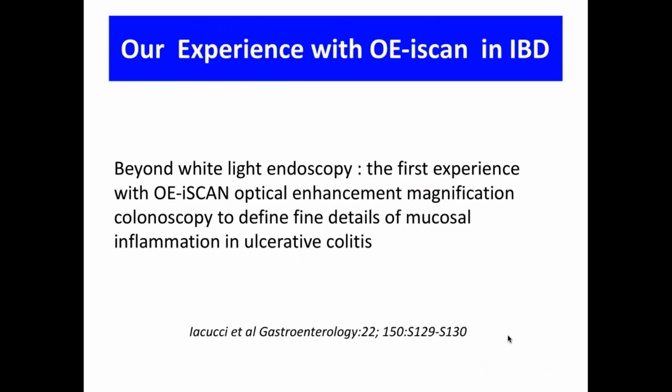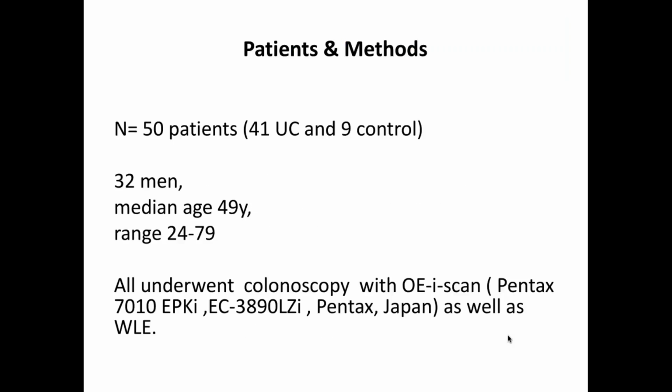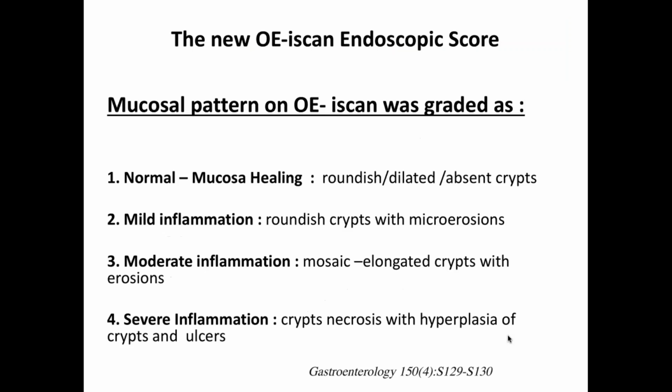So at DDW this year, we have presented our first experience beyond the white light endoscopy using the new optical enhancement. And we have showed that the optical enhancement can see abnormalities in detail. And we have defined for the first time the endoscopic healing in ulcerative colitis. We have enrolled 50 patients, and we have modified and improved the previous virtual OE-iscan chromoendoscopy score.